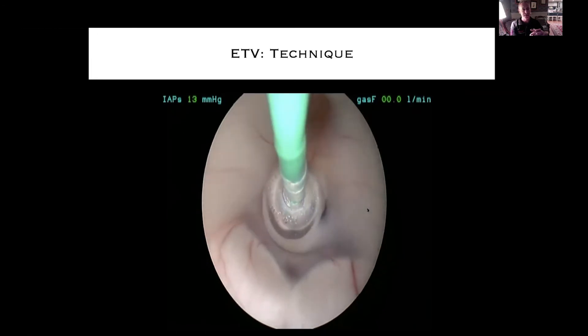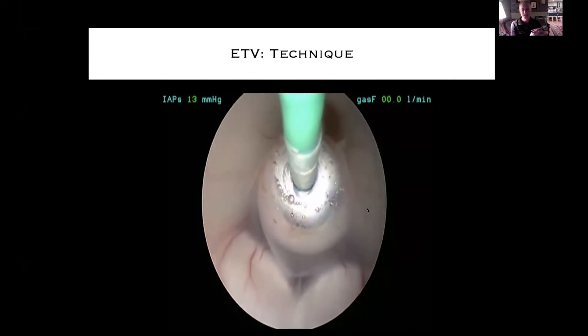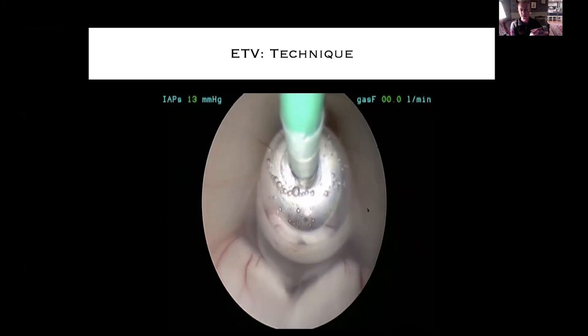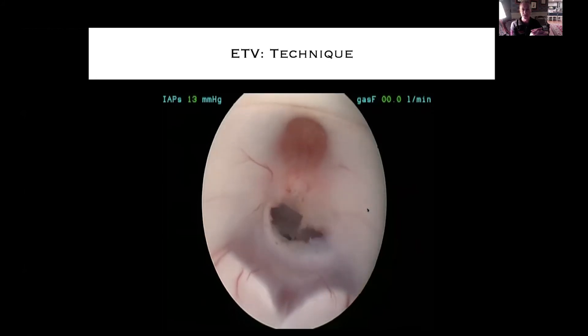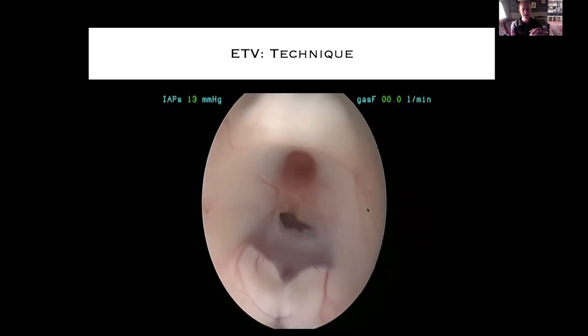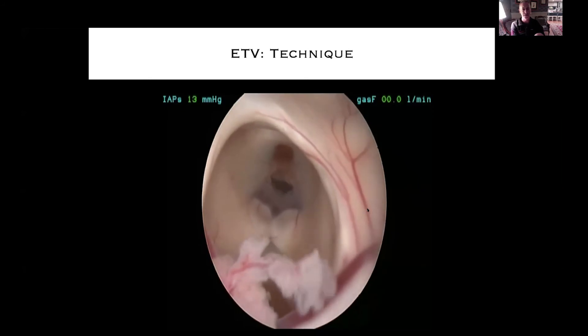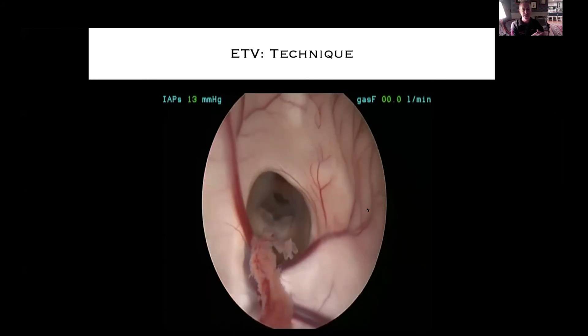Here's the dilation of the balloon — lots of variation in how aggressive you might be with stoma dilation. There are some cases where the floor is so flaccid and redundant that you need to coagulate back the edges a little bit. The floor of the third ventricle is pulsating so nicely — you know that stoma is going to be patent for a long time, there's no way that's going to close off. We inspect the fornix on the way out to ensure no damage from the endoscope. The whole procedure — that baby may be in the operating room for two hours, but the actual endoscopic procedure is about a two-minute surgery. Incredibly rewarding.